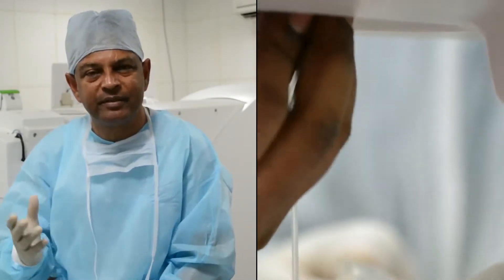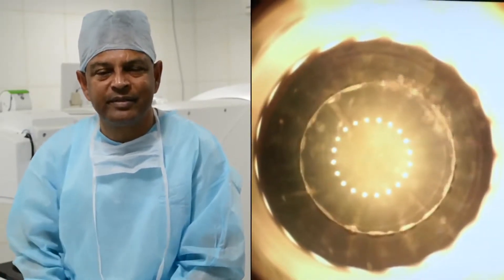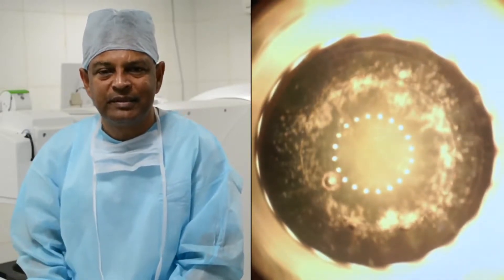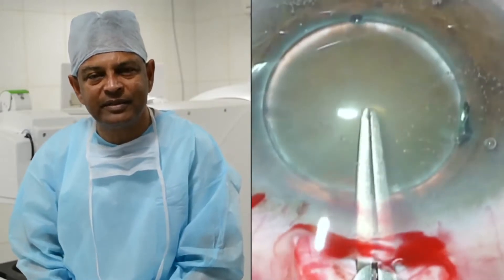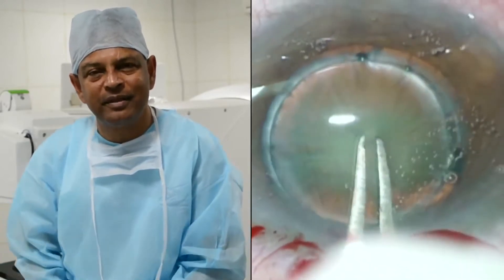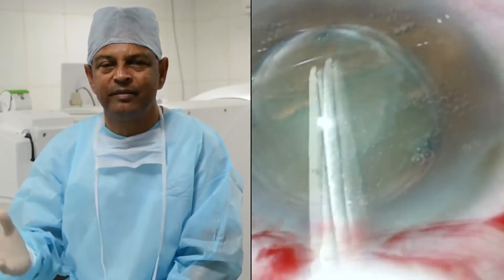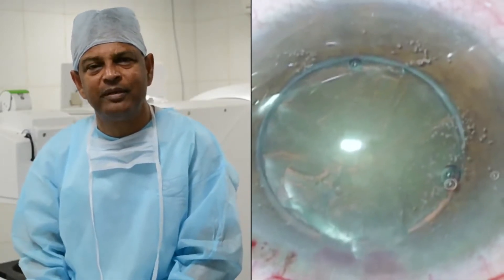This was my second cataract surgery. Initially, we concentrated on simple capsulotomies. I was amazed — I just couldn't believe my eyes that you could do such a precise capsulotomy where the circularity, the centration, and the diameter are concerned. It was simply unbelievable.